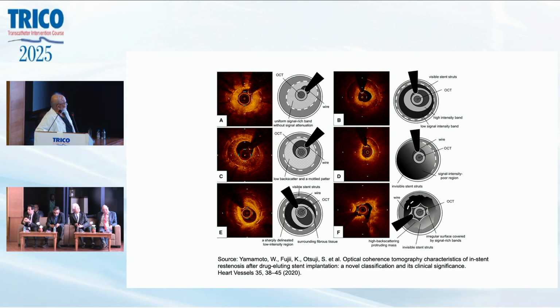Yeah, for those of us that did not grow up in the balloon era, we feel very uncomfortable leaving a dissection in general. And I think the same is true just looking at this. It's going to take a new learning to leave these alone. So balloon era, then balloon and stent era, and then stent, the bare metal, and then the drug-eluting and whatever. I have gone through everything, but I think Malcolm is the senior most person. So we'd like to know from him.